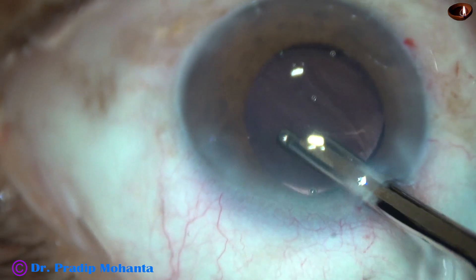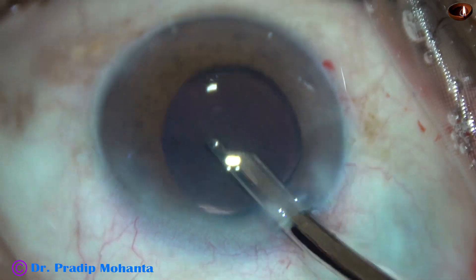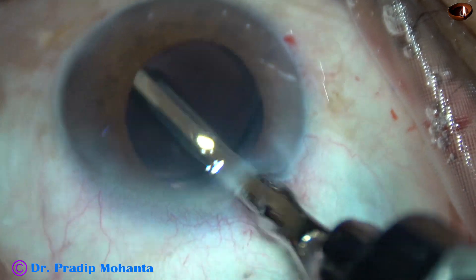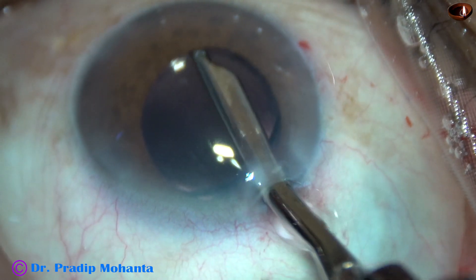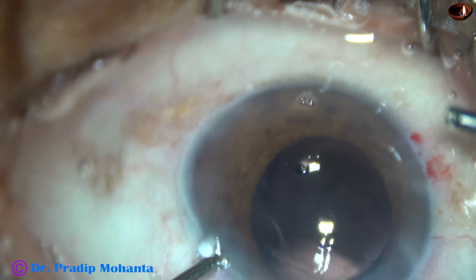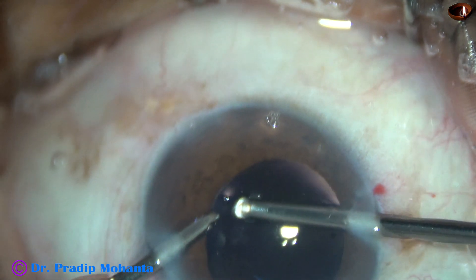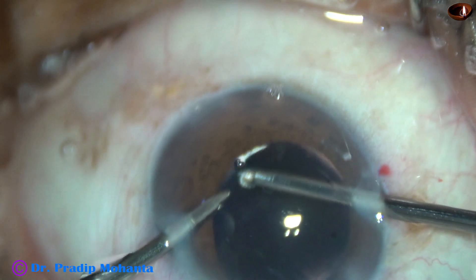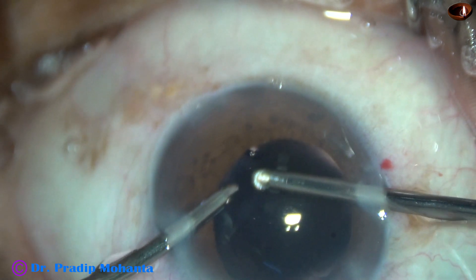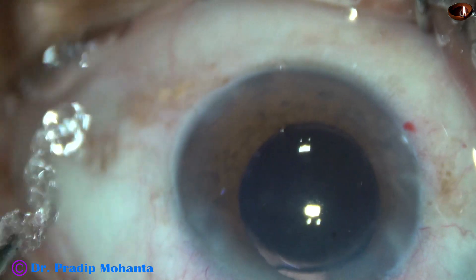And now as I remove the visco from the anterior chamber and the capsular bag, I find some fibers at 5 o'clock. It didn't come out easily so I stopped aspirating. I went again with the cutter and trimmed these fibers because it may be vitreous strands — it may not be cortical fibers. So the cortical cleanup has been nicely done.